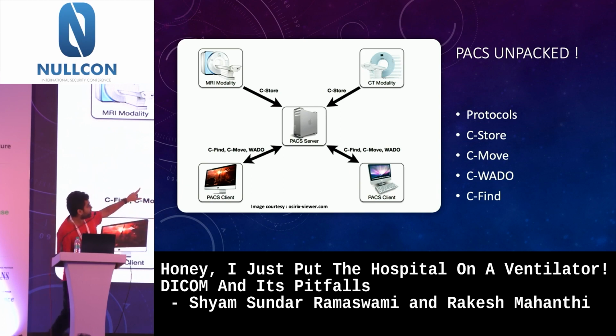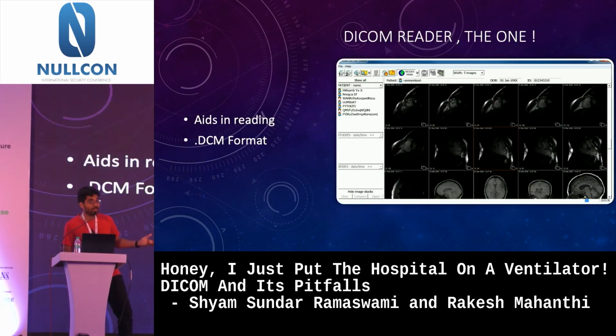If you see something called modality there, it talks about a CT scan, an X-ray machine, or an MRI machine. Those scanned images move around to the centralized database or this communication system using protocols like store, move, and so on. I'm not going into detail, but I'm giving you enough background because juicy things are coming. Okay? Cool. Now, when I have it, I need something to view it. How am I going to view it? That is called a DICOM reader. So I use a DICOM reader to open these X-ray images.